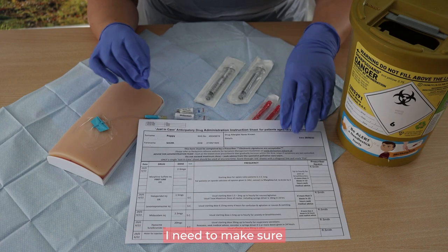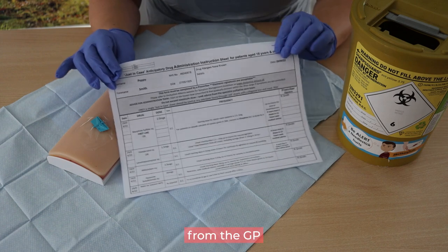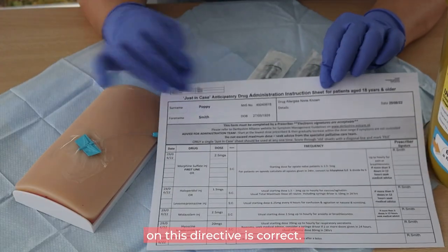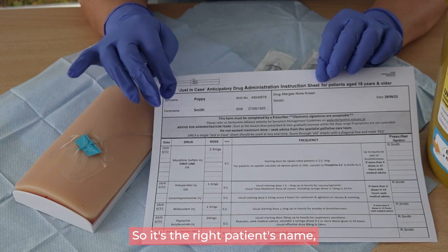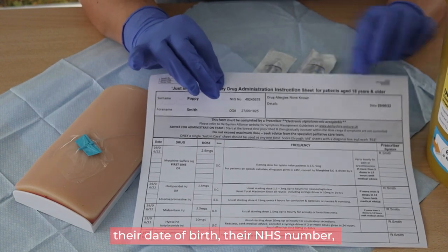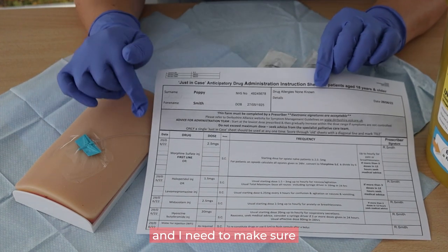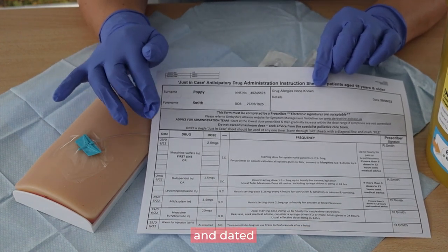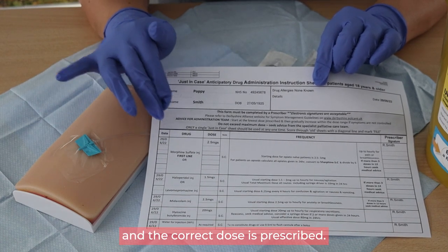First of all, I need to make sure that I've got a written directive from the GP and that everything on this directive is correct — the right patient's name, their date of birth, their NHS number, any allergies — and I need to make sure that each medication is signed and dated and the correct dose is prescribed.